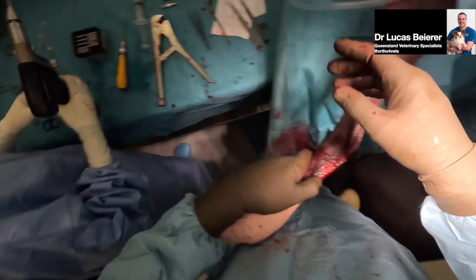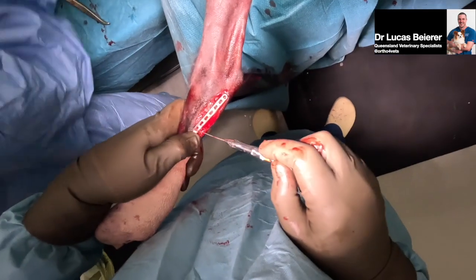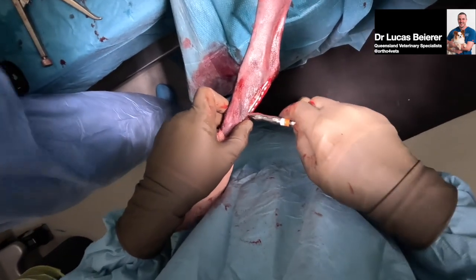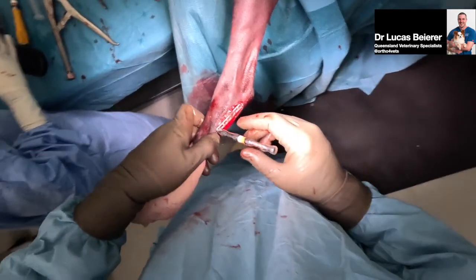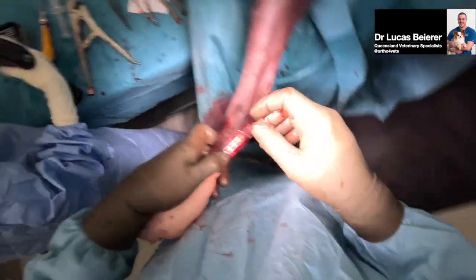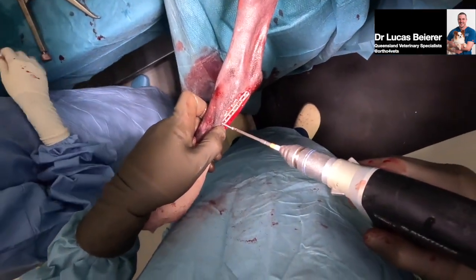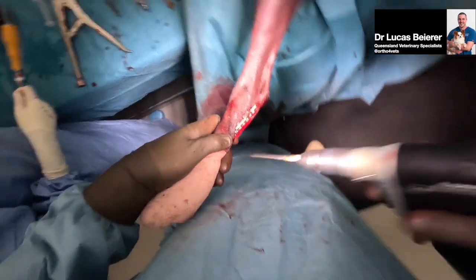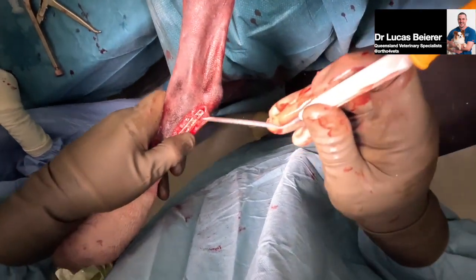I'm not sure if that's across all four or whether we've got three and missed one, but depth gauge, we'll take that. We've chosen a cortical to reduce how far we have to go with our plate, because that cortical screw is a bit closer. It measures a 28, might put a 26 in just to avoid it poking through the skin. There's always the risk that that's gone across the joint space as well, but it's not of great consequence.